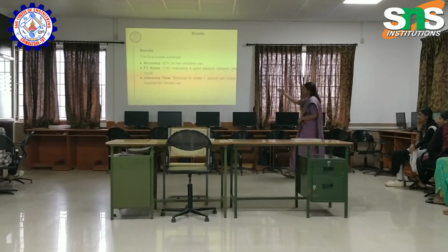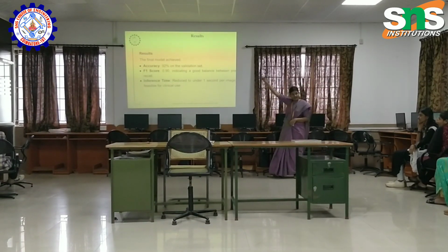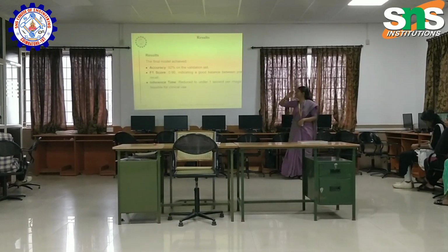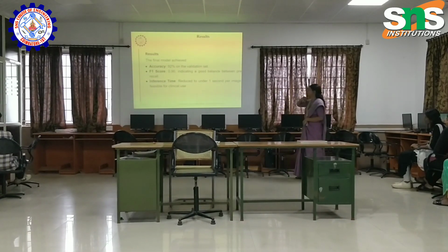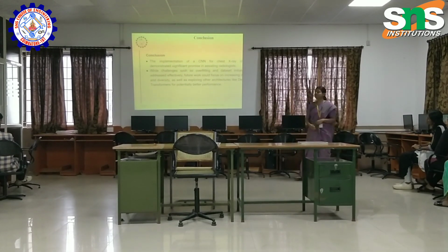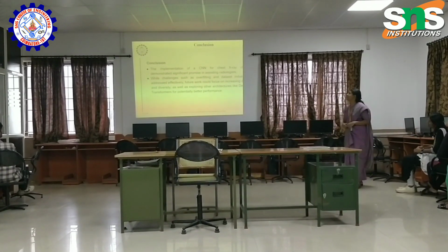Yes, next. This is the result. 92% accuracy was achieved by this model, and the F1 score is 0.90, and inference time is reduced to under 1 second per image, feasible for clinical review. Yes, next. This is the conclusion: we have implemented a convolutional neural network for chest X-ray image classification.